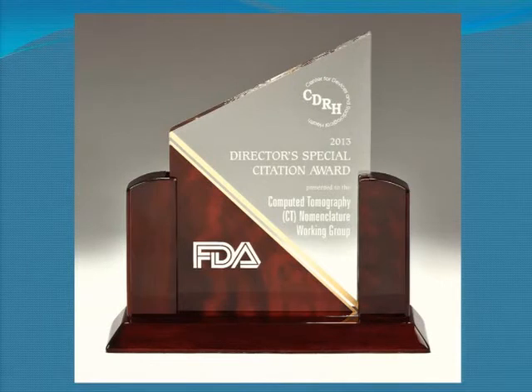In this tab about those that you guys are putting together, are you planning to put like organ doses, a table of organ doses for each protocol? Okay, so the question was, are we going to ever put organ doses in the CT protocol piece? Right now, what we have are CTDIvol ranges for most of the body exams because there is no one value that's ever going to make sense.